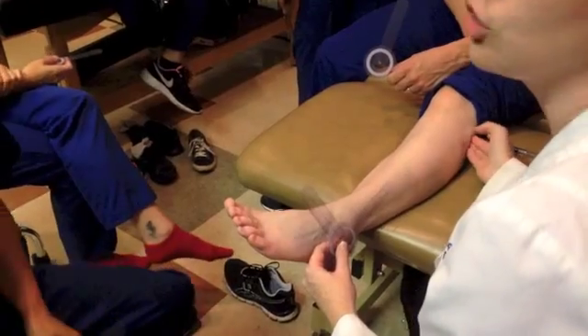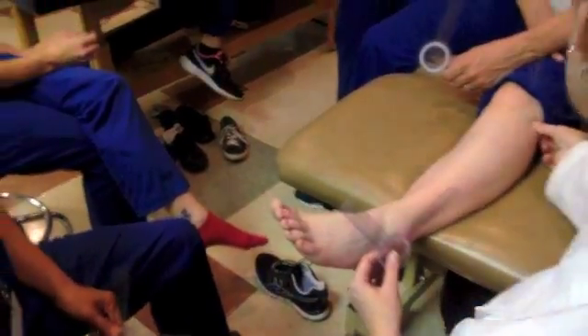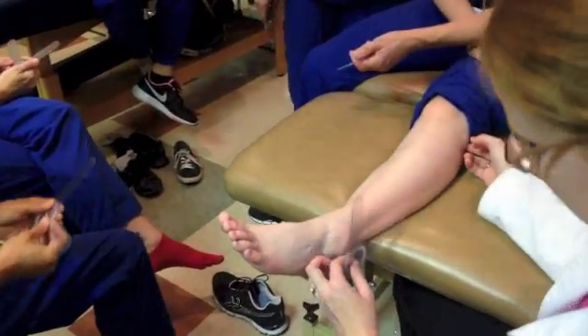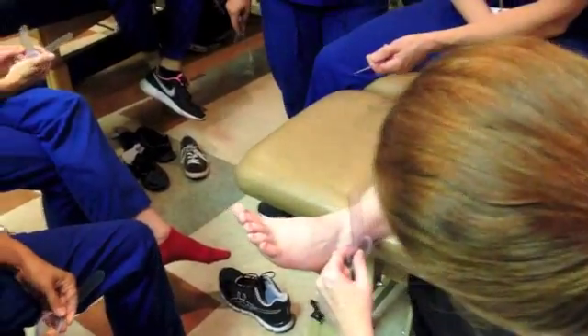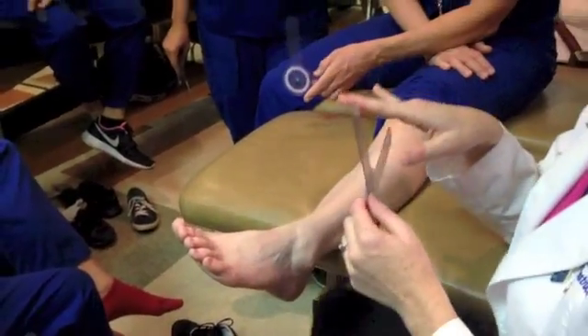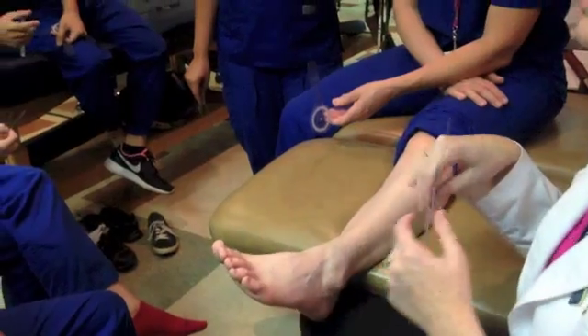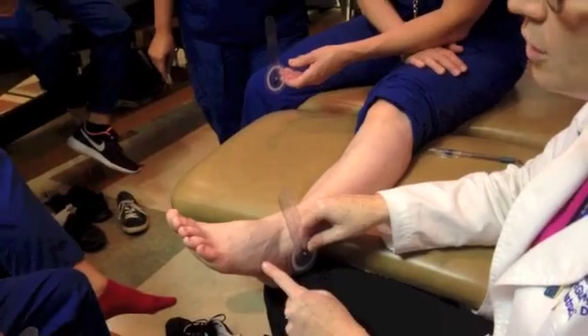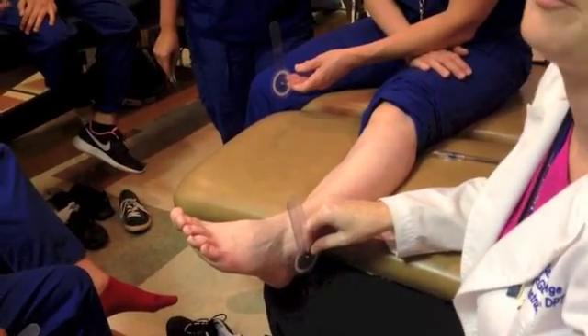Don't pinch too hard because there's a nerve behind it, so your patient will jump. I have to make sure my stationary arm stays there. Now the moving arm is a little bit tricky — we're lining it up parallel to the fifth metatarsal, but the fifth metatarsal is actually going to be down here, so we just have to make sure it's parallel to the fifth metatarsal.